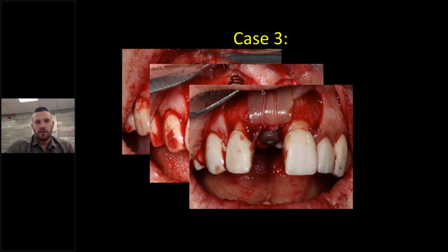And so here is when I started really suturing everything into place and really getting my technique for doing that. The biggest thing that is important when you're trying to suture these membranes into place is that you have, I call it a periosteal pocket. When you're elevating your flap, you want to do a full thickness flap. I typically do a full thickness flap for about 7 or 8 millimeters, and then I stop and actually start to do a periosteal release at that point.